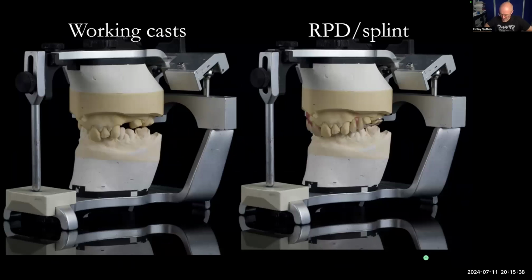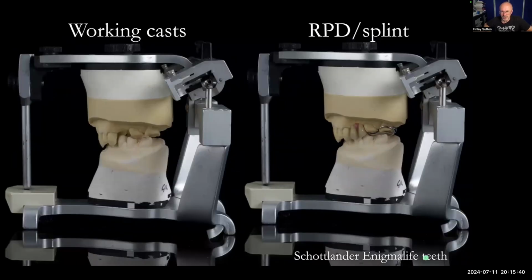So that's the denture finished, back on the articulator. The other important thing that Rowan does is we always keep our working casts. So Rowan does everything on duplicates of the working cast. And so I've got these mounted working casts, which we can then store in the future, should we need to add teeth onto the denture, or should we need to start again. It's just there as a record. In the future, we'll be able to scan these, scan the denture, and have a really good copy of that.